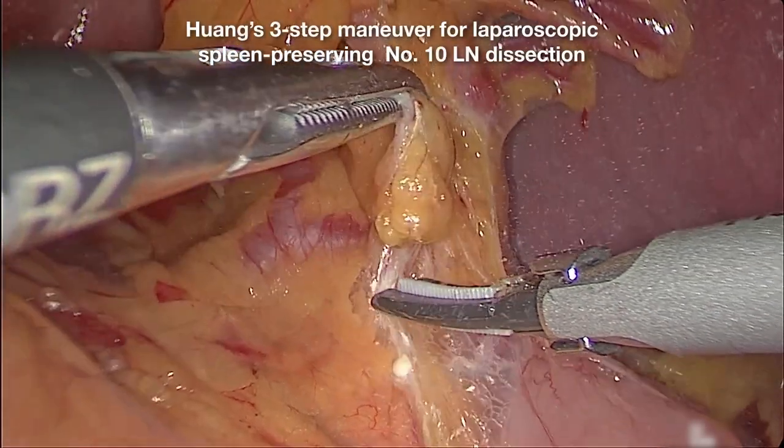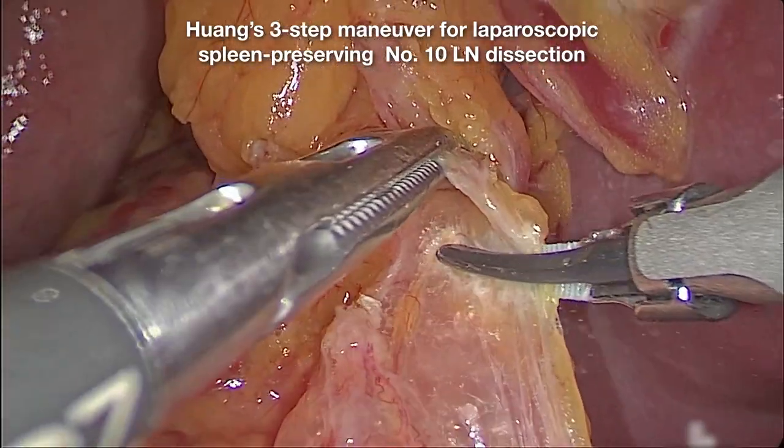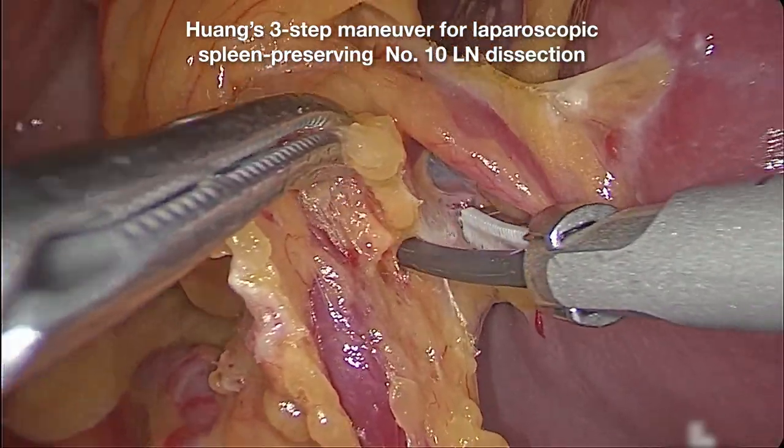The video shows the operation of laparoscopic spleen-preserving number 10 lymph node dissection for advanced proximal gastric cancer and left approach.